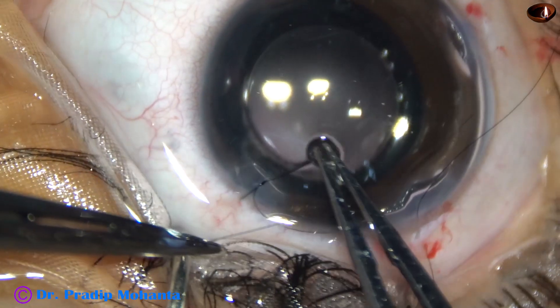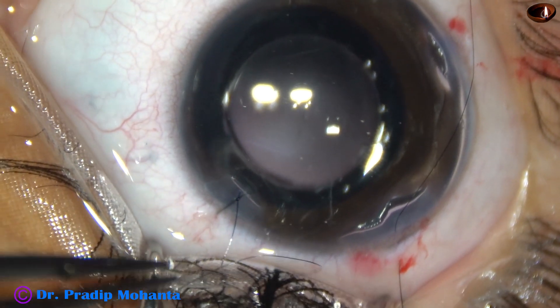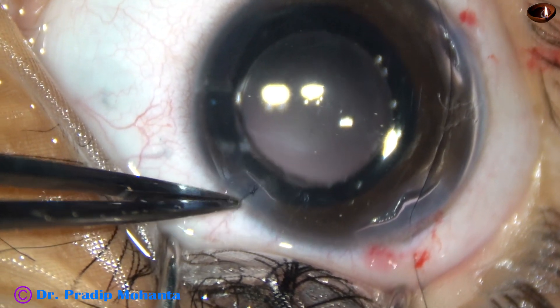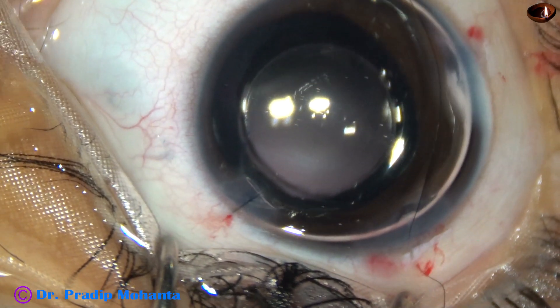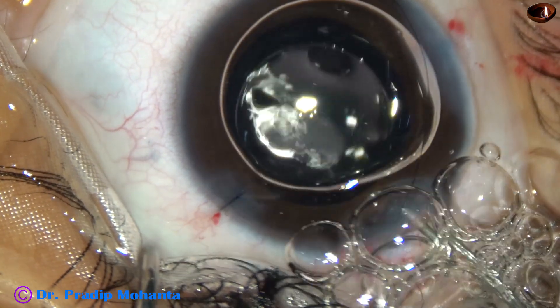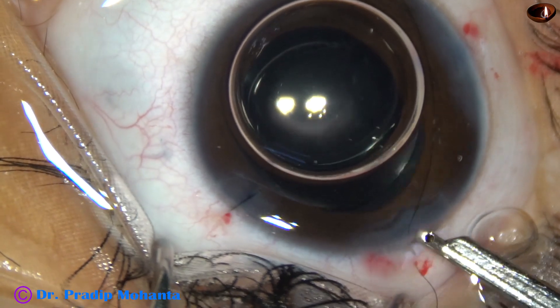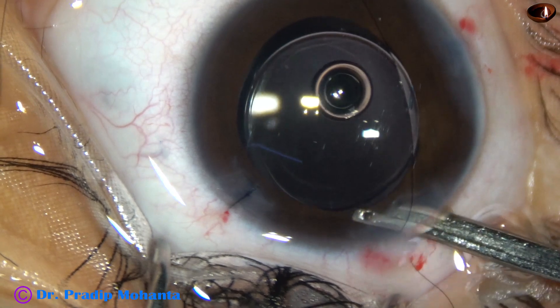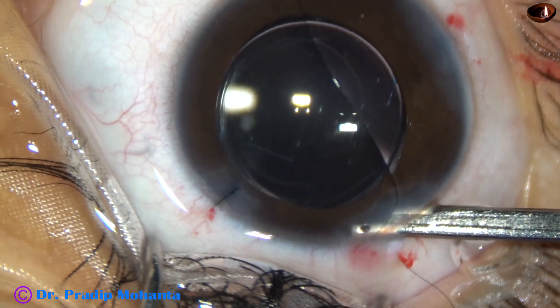This is intracameral pilocarpine from Sunways — 1% pilocarpine. This is the knot and the knot is buried into the tissue. This is moxifloxacin being used to hydrate the right side port. Now let me check if the anterior chamber is stable or not, and I form the anterior chamber and find that there is no leakage from the main wound also.